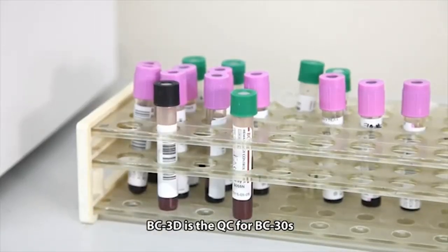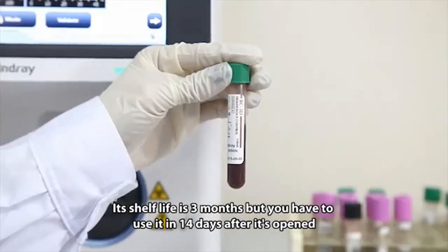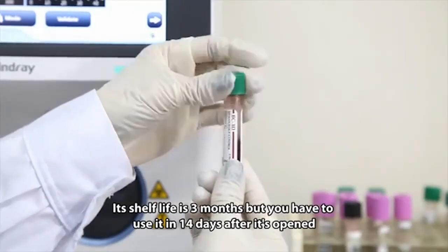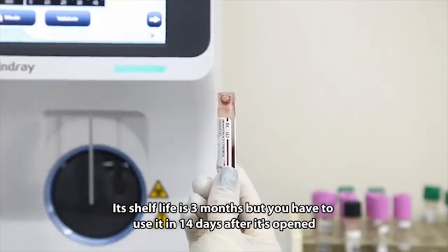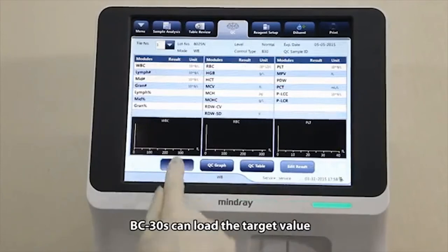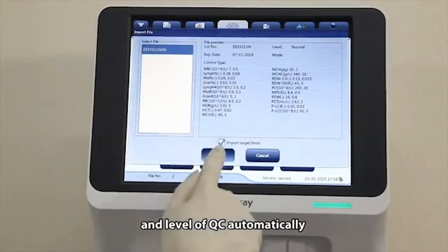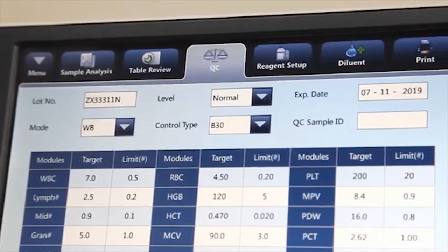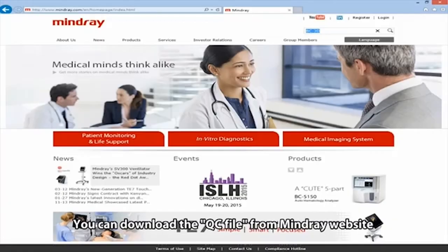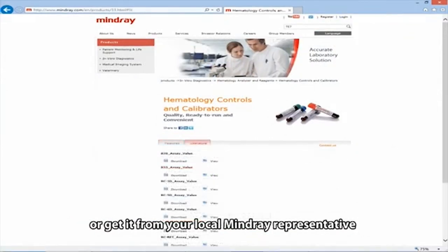BC3D is the QC for BC30S. Its shelf life is 3 months, but you have to use it in 14 days after it's open. After importing the QC file, BC30S can load the target value, lot number, expiration date, and level of QC automatically. You can download the QC file from Mindray website or get it from your local Mindray representative.